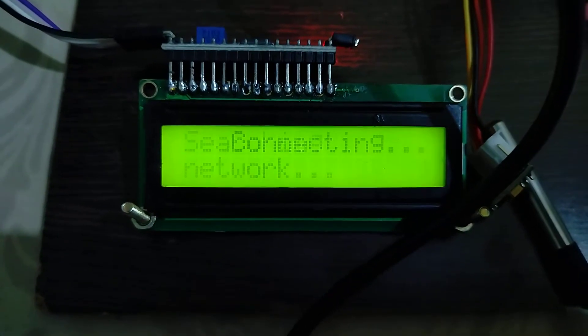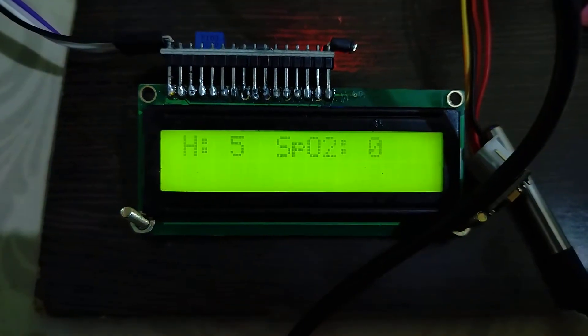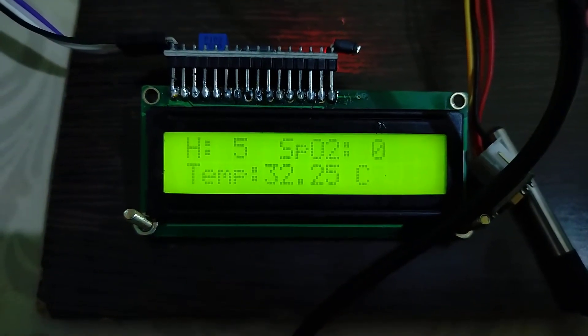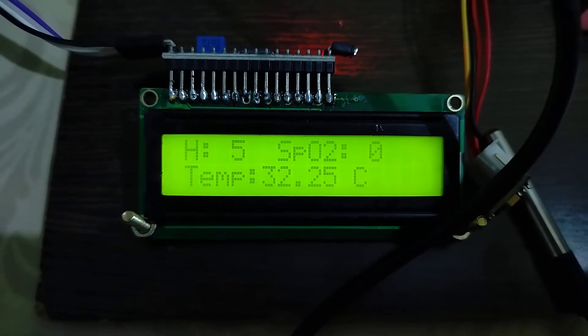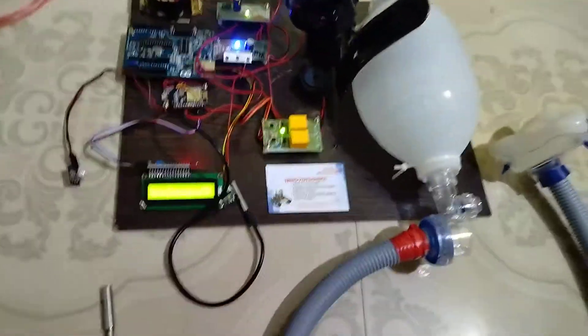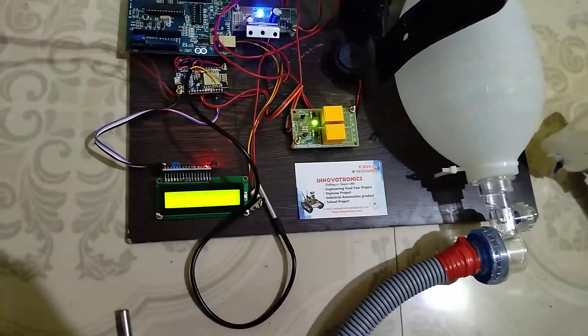Actually, there is no Wi-Fi network, so it will automatically wait. You can see the heartbeat is 5, SPO2 is 0, temperature is 32, which means there is no finger inside the sensor. So it will automatically give a buzzer alarm. Now I'm going to place my finger inside the sensor.